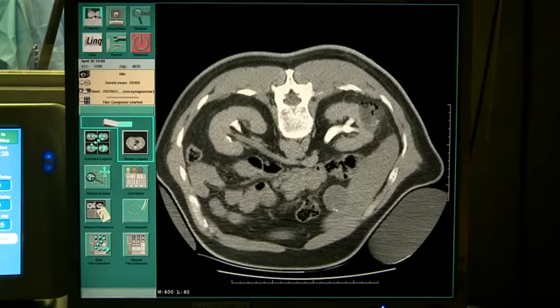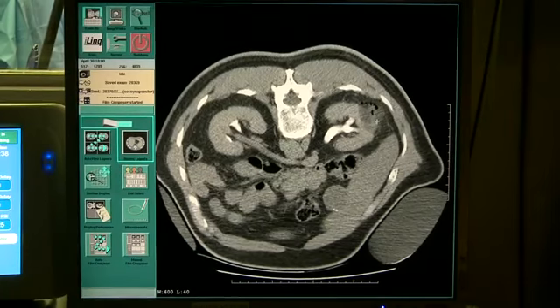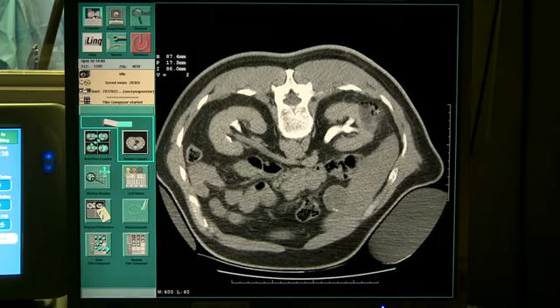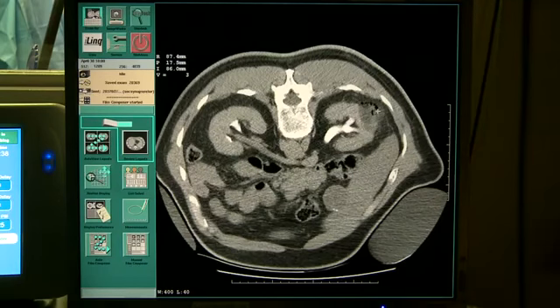People talk about bleeding as a complication of cryo. It's very, very rare. I've done a couple of hundred renal cryo cases, and I've had 2 guys that bled significantly. One required a 1-unit transfusion, the other a 2-unit transfusion. People will bleed afterwards, but surprisingly it's uncommon, and it tends to be minimal. Depending upon how much you bleed afterwards is also how sore you'll be afterwards. If you don't bleed, you won't be sore the next day at all. If you do bleed, you'll be sore like if you had a renal biopsy.